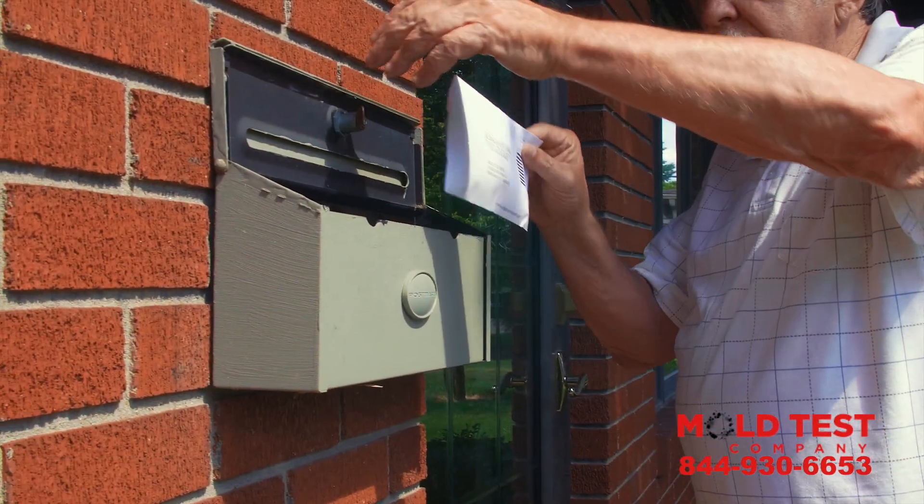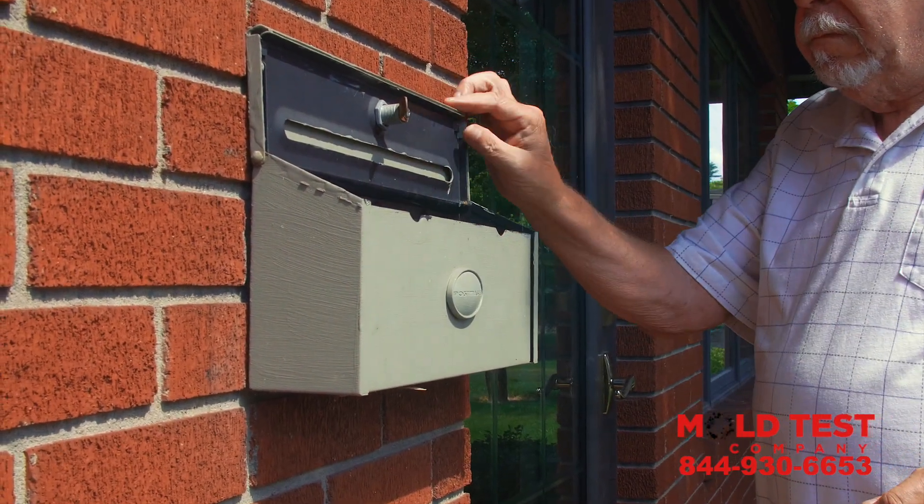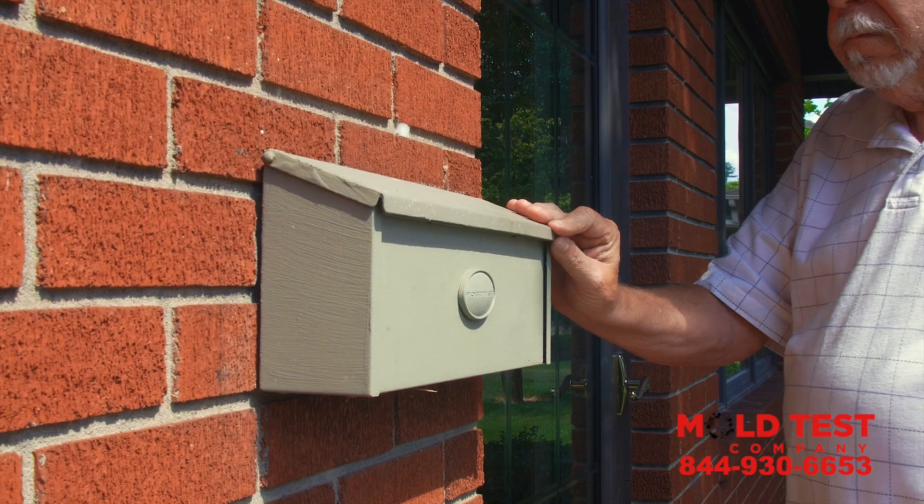Step 7. Send your test back to us for free through USPS. Mold Test Company will contact you with your results in 7 to 10 business days.